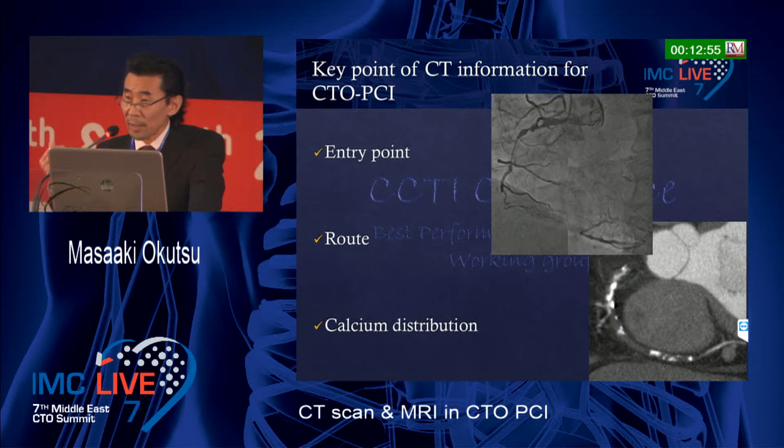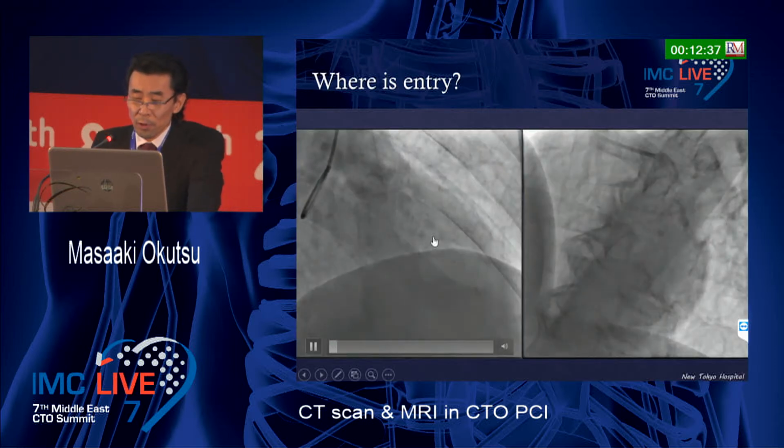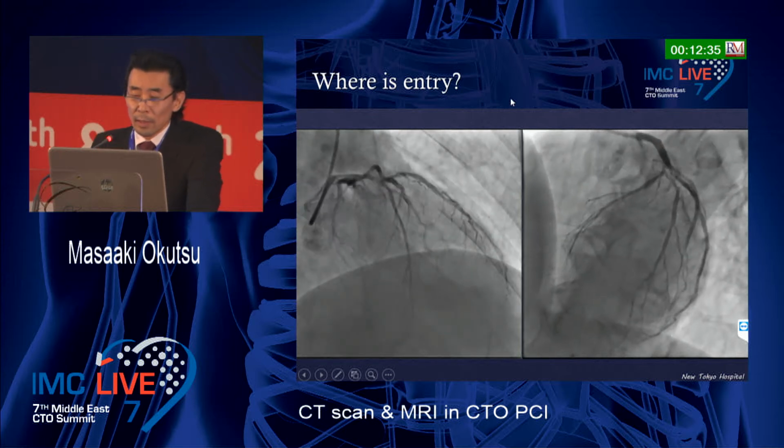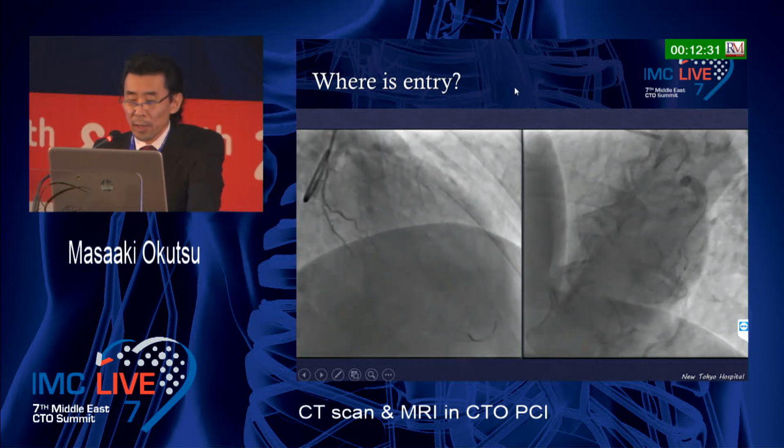The first case is also a calcified segment. Where the calcium is, is very important. This is so useful for the treatment of CTO PCI. First, this is the entry point. As you can see, this middle LAD is a CTO.